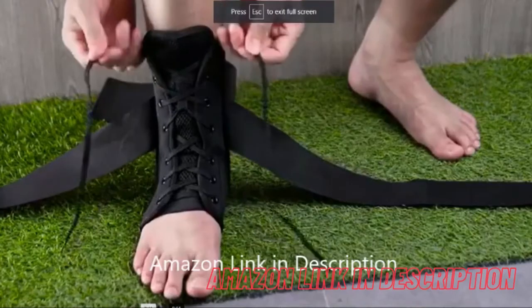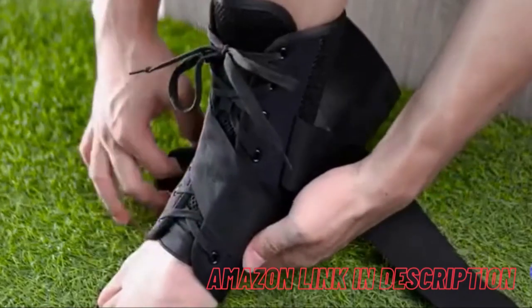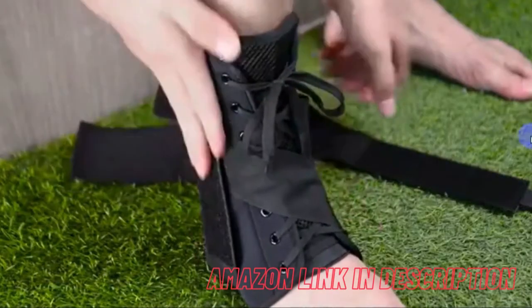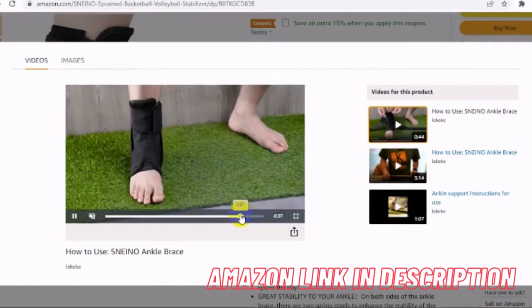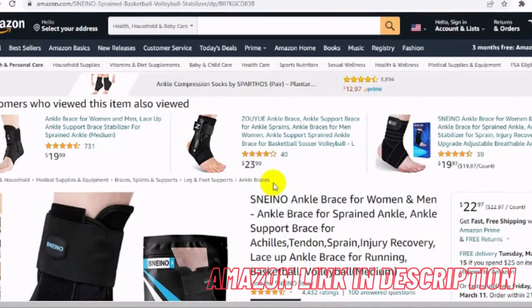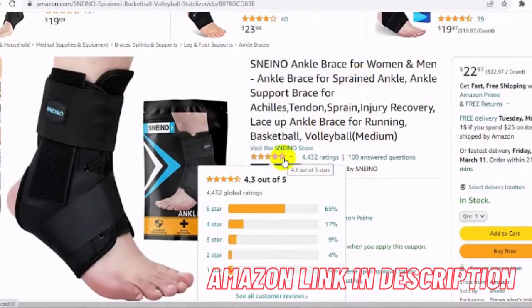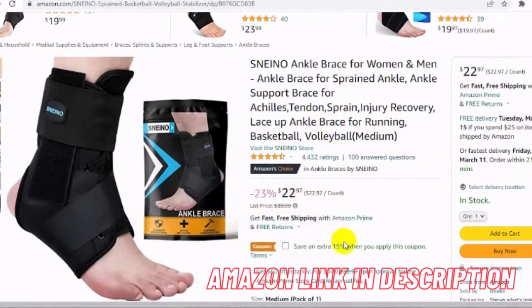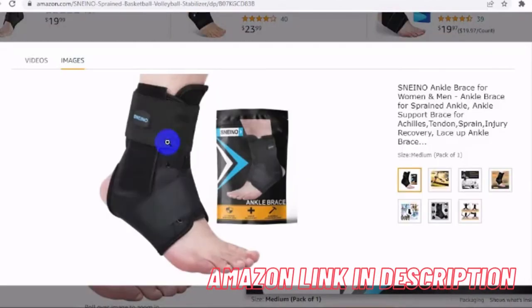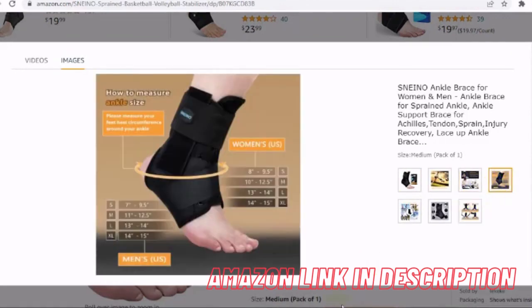Relieve your pain and stay comfortable: the Sneino ankle brace with reinforced side stabilizer and curved arch design can quickly reduce pain and pressure on the ankle. It can also help with Achilles tendonitis, joint pain, minor sprain pain relief and injury recovery. This ankle brace for sprained ankles is also an ankle stabilizer recommended by orthopedic surgeons. Choose the size that suits you — because not all feet are the same, we designed an adjustable lace-up ankle brace to adapt to various shapes and sizes.